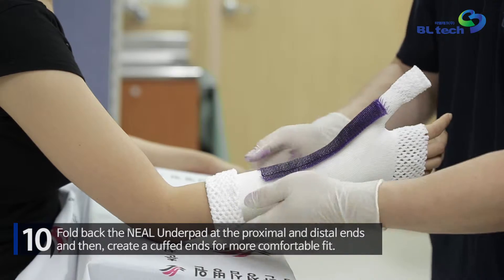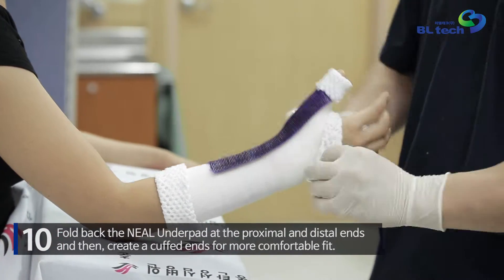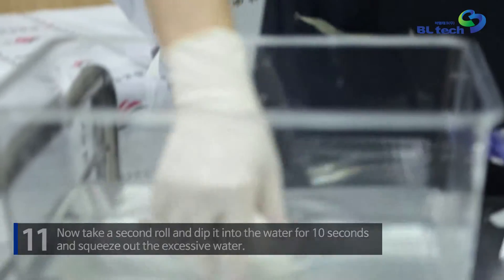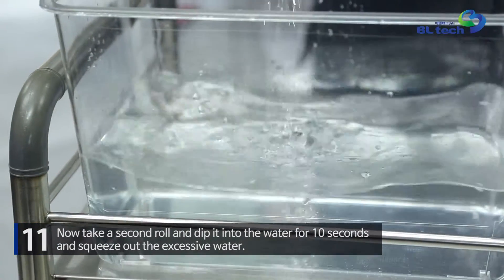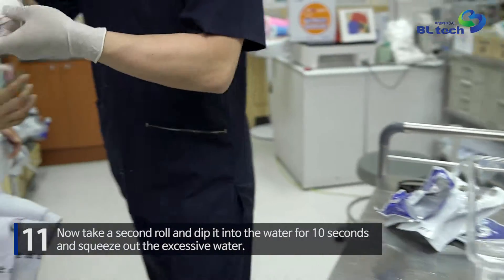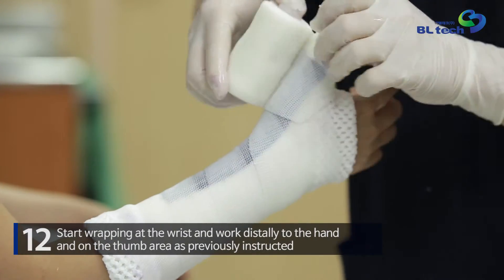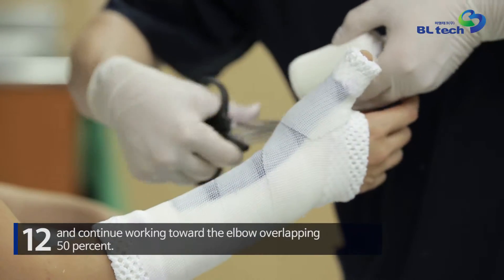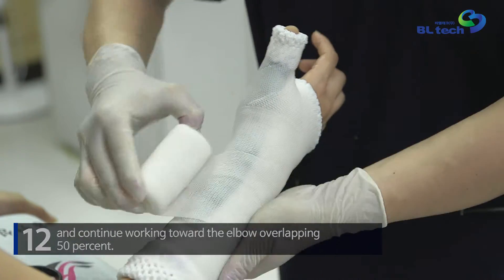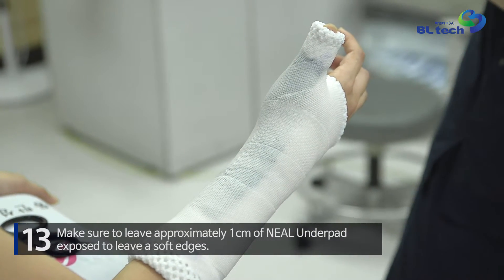Fold back the Neal Underpad at the proximal and distal ends, then create cuffed ends for a more comfortable fit. Take a second roll, dip it into water for 10 seconds, and squeeze out the excessive water. Start wrapping at the wrist and work distally to the hand and on the thumb area as previously instructed, then continue toward the elbow overlapping 50%. Make sure to leave approximately one centimeter of Neal Underpad exposed to leave soft edges.